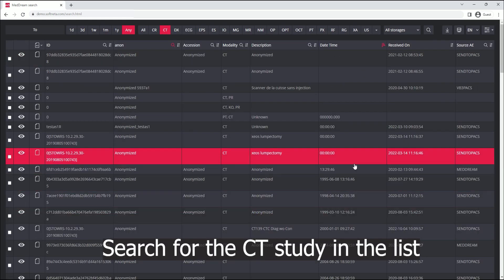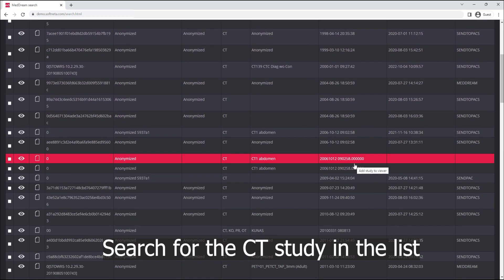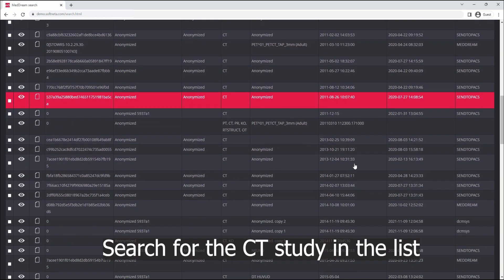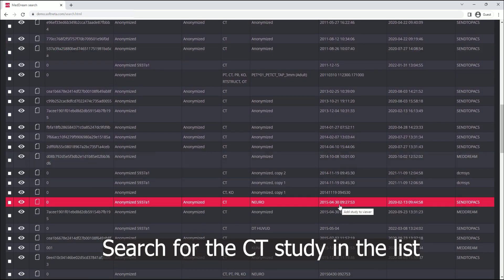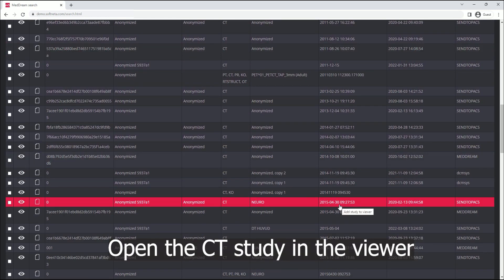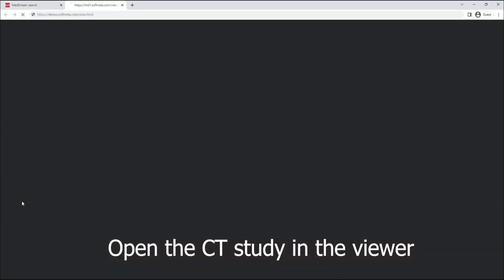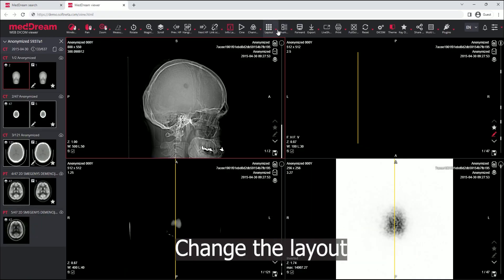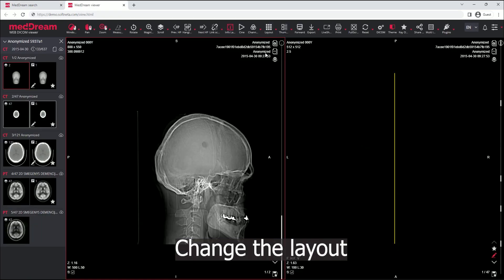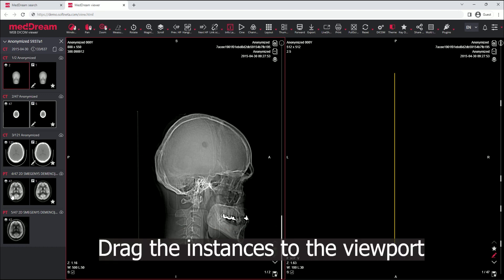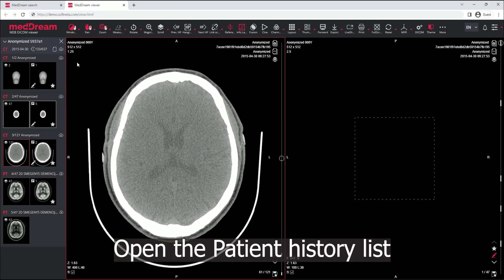Find the CT study in the search window. Open the CT study in the viewer. Change the layout of the viewport. Drag the instances to the viewport.